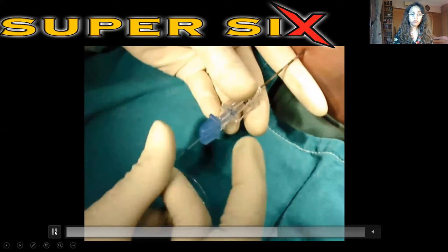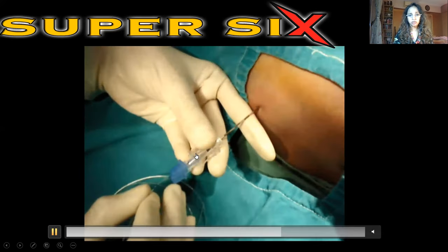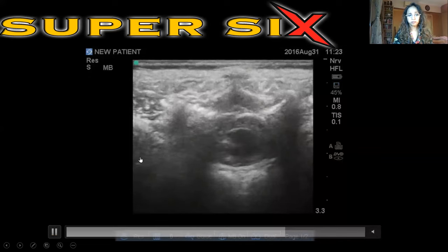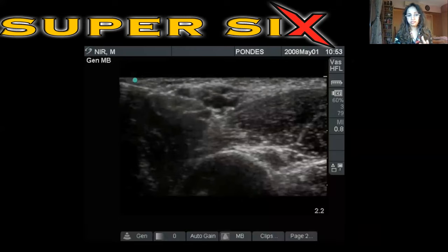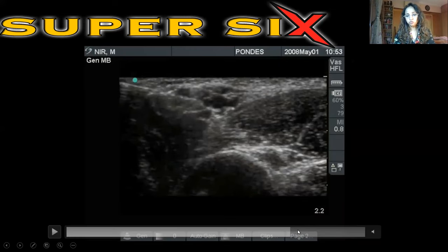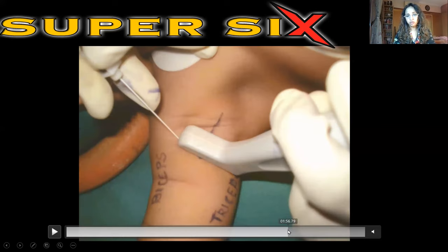We can even see this under ultrasound, and you will see the flicker here. Now coming to another everyday block, an axillary block. You saw a glimpse of how it can be seen, the probe especially, and the needle. This is how it goes. So it need not always be a hockey stick probe. It can be any high frequency linear probe, and this is how the needle gets in.